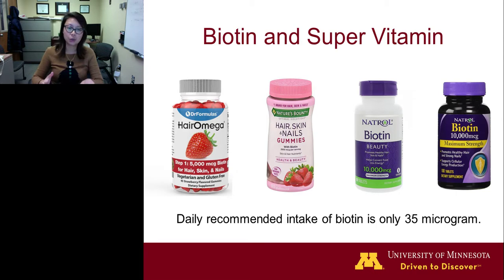However, recently there's a trend of taking very high doses of biotin for health and medical reasons. Biotin is known as a supervitamin, and people take it in very large quantities, such as 5, 10, even 20 milligrams daily, for help with their nail and hair growth and for other reasons.